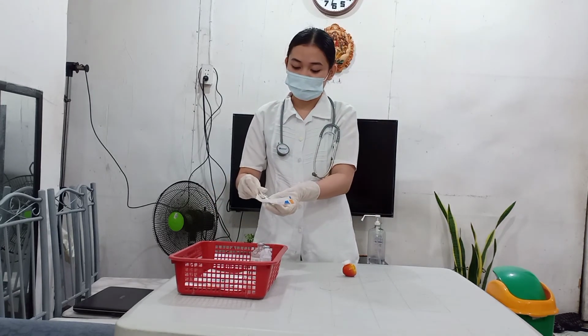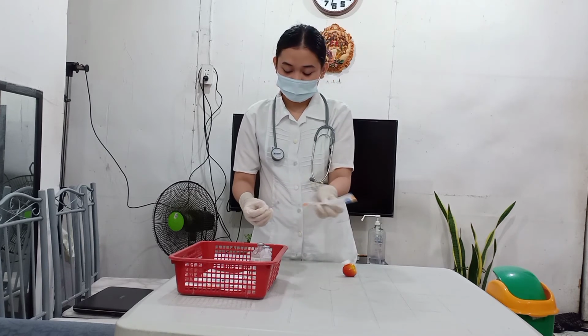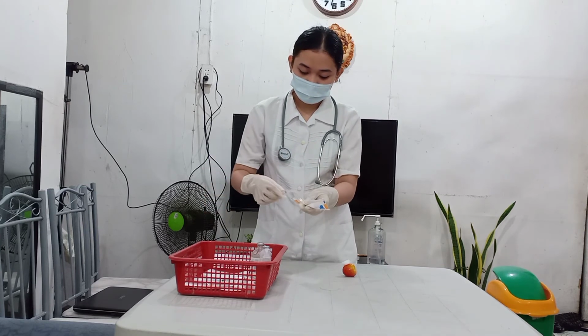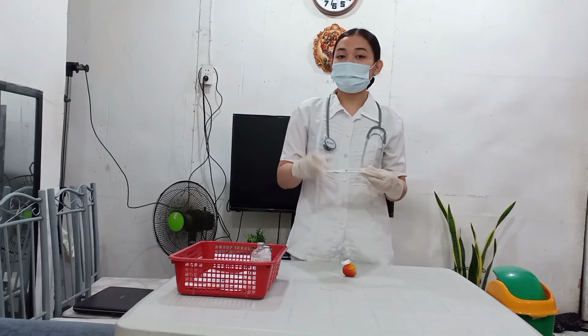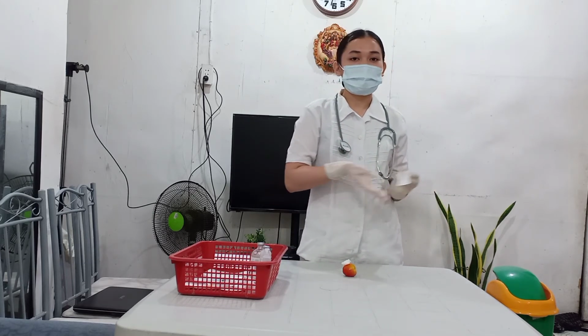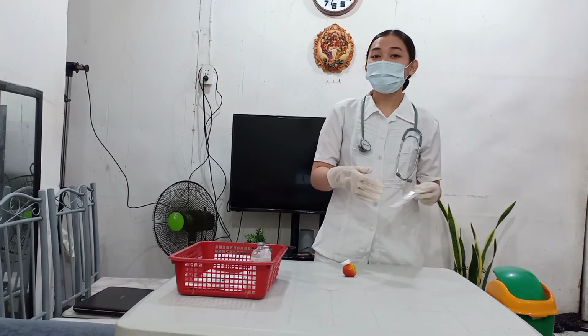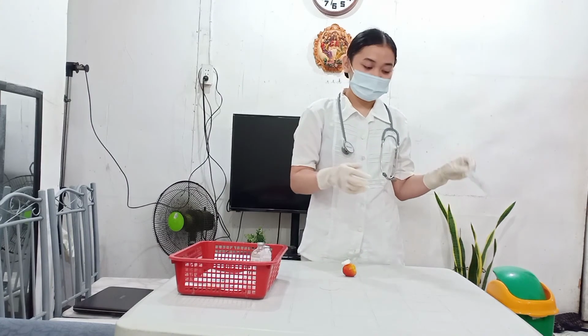So, we are going to dispose of this. Ideally, we place it in a sharps bin. So assuming that I have a sharps bin here, I am going to dispose of this used syringe in this bin.